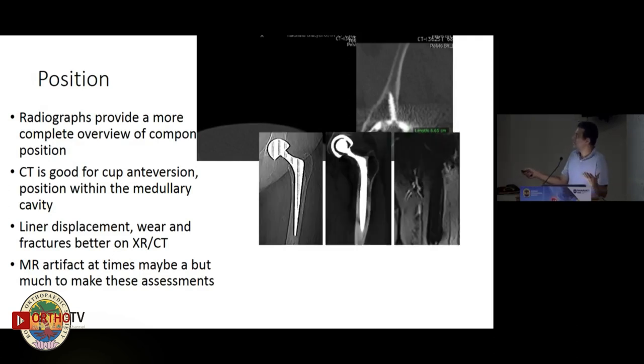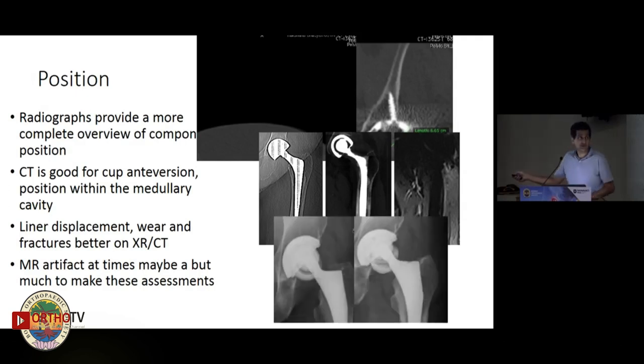Radiographs give us a really nice idea of certain aspects of position. CT gives a good picture of anteversion and axial positioning. Liner displacement, wear, and liner fractures will also be seen better on CT. For example, here you can see a fractured ceramic cup. A metal artifact at times may be a bit much to make these assessments clearly.